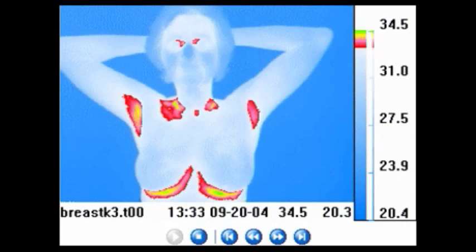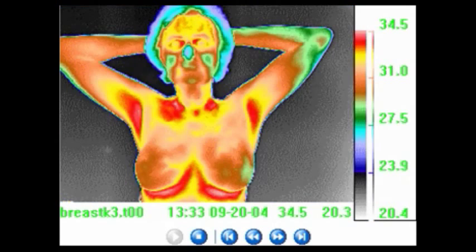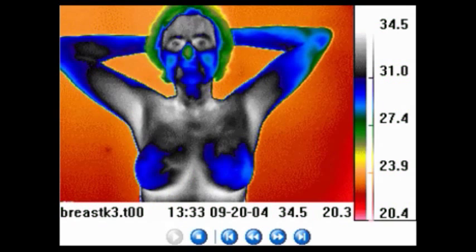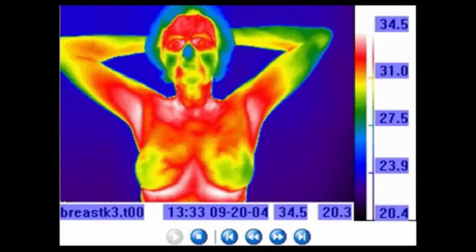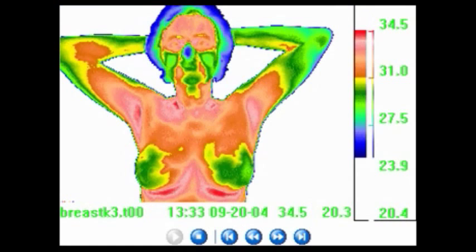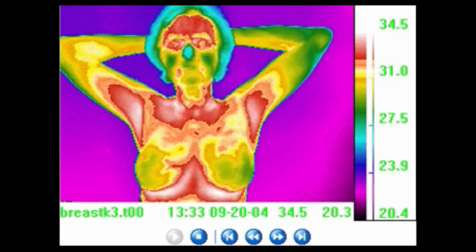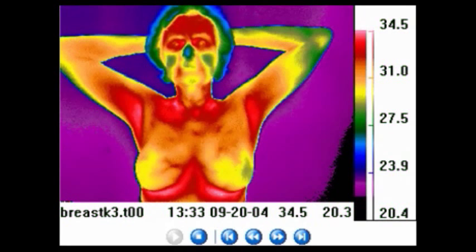Telethem Infrared provides 50 standard palettes with their cameras and the user can create their own custom format. Go to thymology.com for further information.